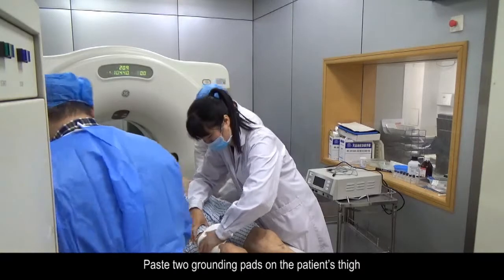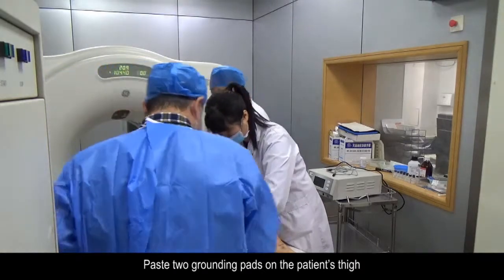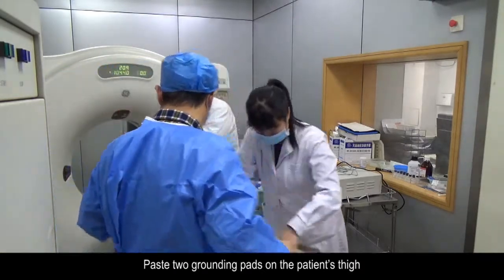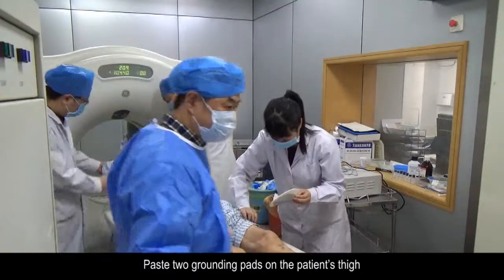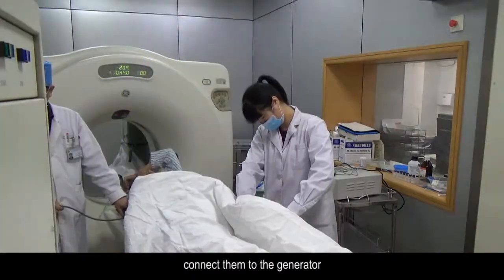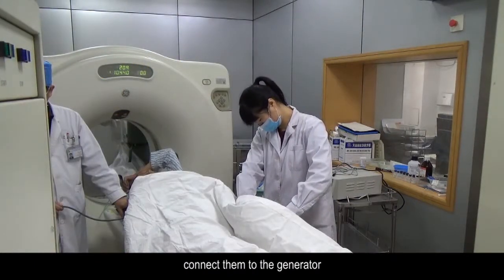The patient lies on their back. Paste two grounding pads on the patient's thigh and connect them to the generator.